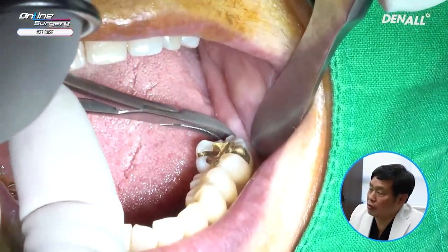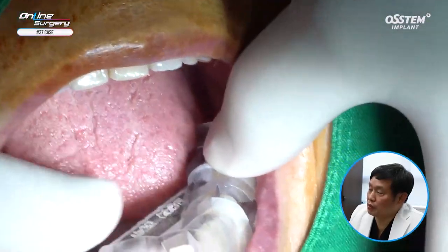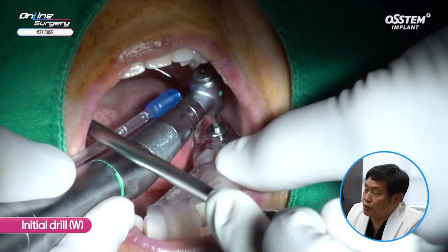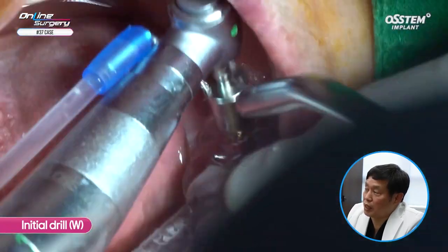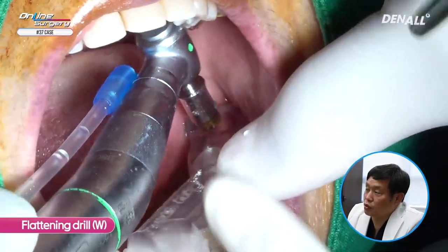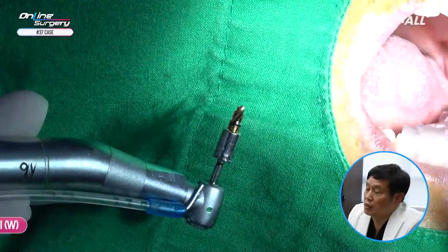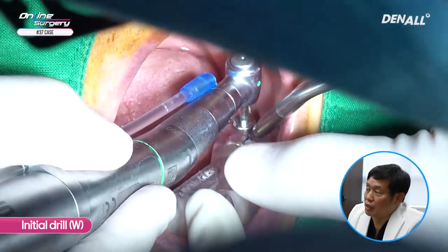The template is removed. I'm removing tissue that was not fully removed, then the template is repositioned. I'm using a wide-type initial drill. The initial drill did not go in fully up to the stop, so in this case I use a flattening drill to remove the bone on top. After that, the initial drill can go in fully. Initial drill needs to be done full length to utilize the double-contact concept when drilling with other drills.